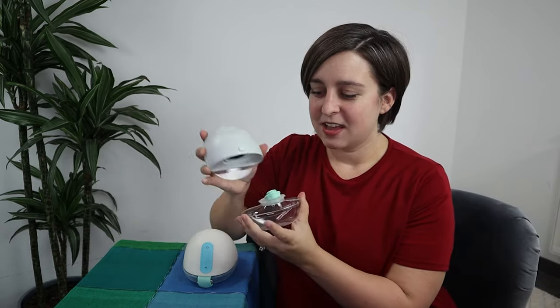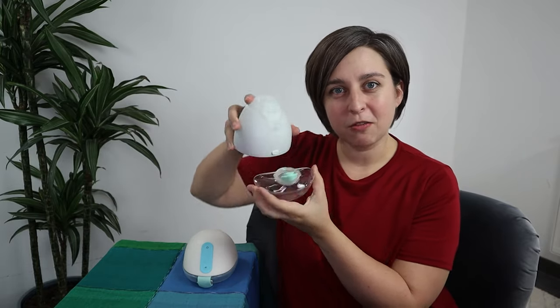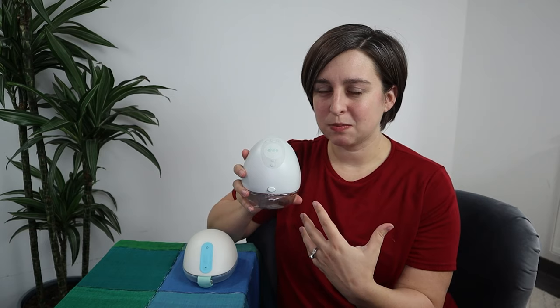The next category is mobility — how much can you really move around with these two pumps? With the Elvie, it has a hard plastic bottle so it has to stay upright. If you bend over it's likely going to leak. With the Willow, if you're using the reusable milk containers the same rules apply. But if you're using the bags, you can pump in any position you want — I even pumped during yoga with zero leaks. So the mobility point goes to Willow.